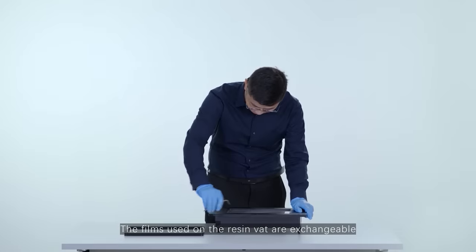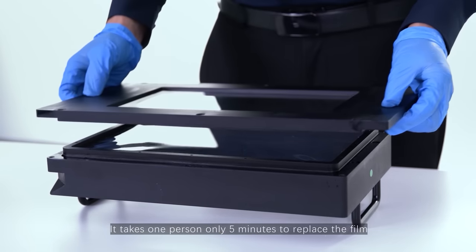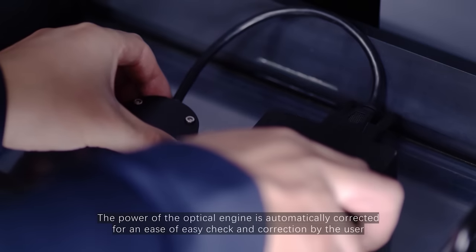The films used on the resin vat are exchangeable. It takes one person only 5 minutes to replace the film. The power of the optical engine is automatically corrected for an ease of check and correction by the user.